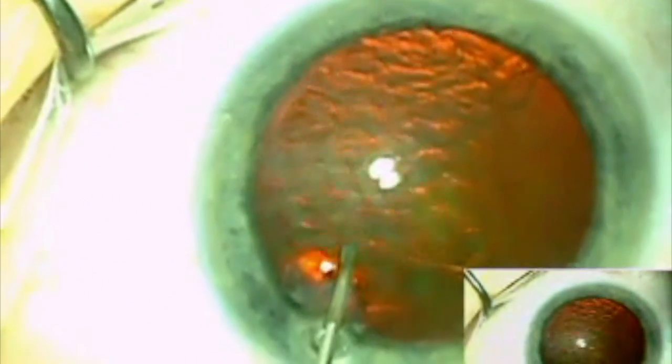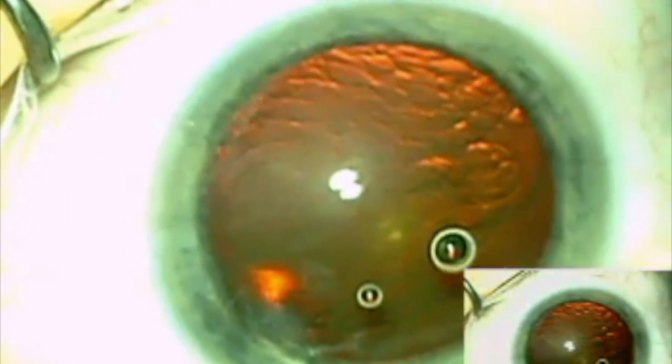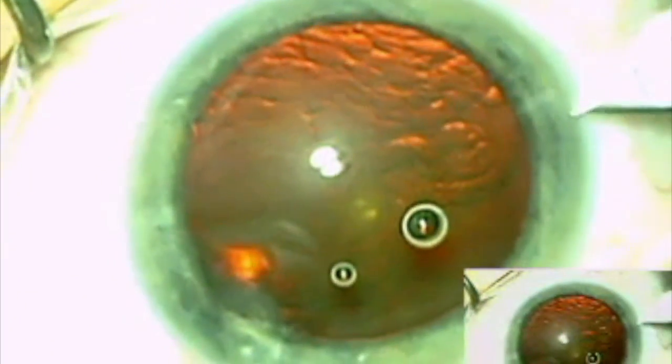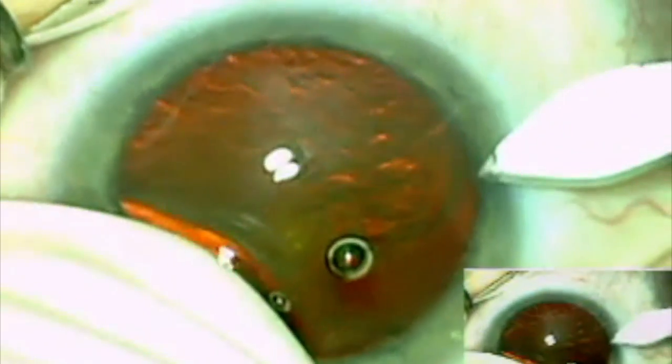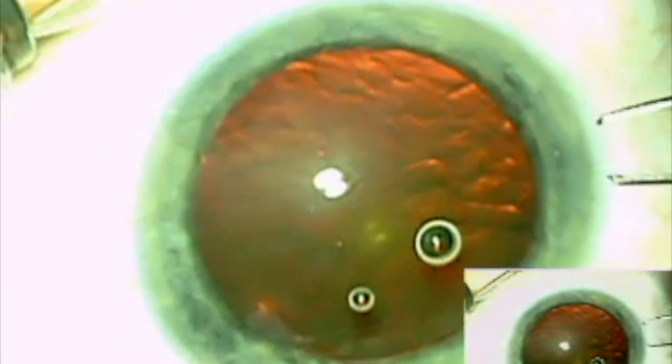Once the eye has been anesthetized with preservative-free lidocaine, the anterior chamber is filled with viscoelastic. The keratome is used to enter the anterior chamber and a continuous curvilinear capsulorhexis is performed.